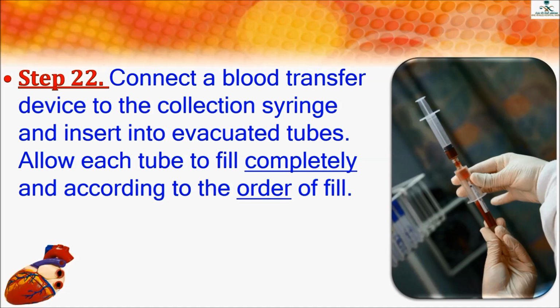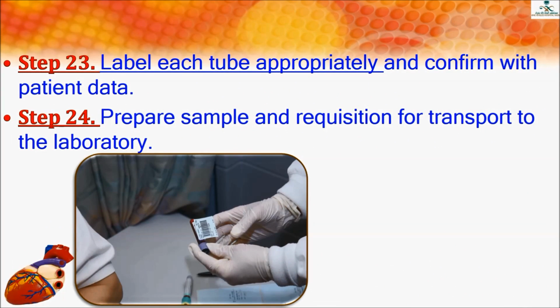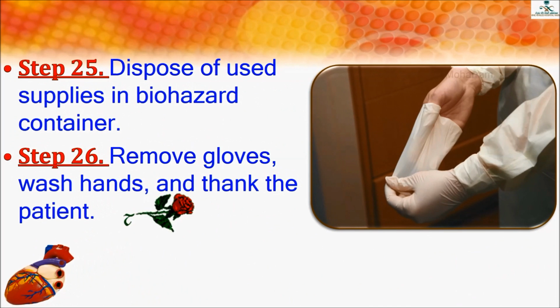Allow each tube to fill completely and according to the order of fill. Label each tube appropriately and confirm with patient data. Prepare sample and requisition for transport to the laboratory. Dispose of used supplies in biohazard container. Remove gloves, wash hands, and thank the patient.